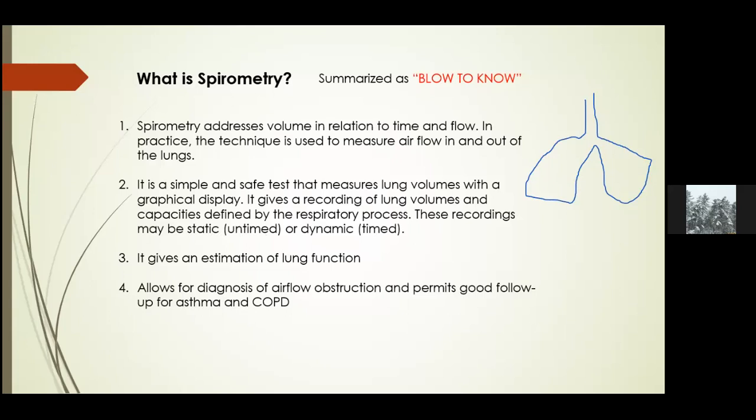However, when we start looking at how much time you take to move that air from outside to inside, so I can tell you to forcefully exhale, remove the air in your lungs as fast as you can, then in that case, we are taking into account the time taken to remove that amount of air. Then in that case, we'll be doing a dynamic recording. So that's the difference between dynamic and static. So what is the purpose of measuring the volumes of air or even the rates at which you move in the air?